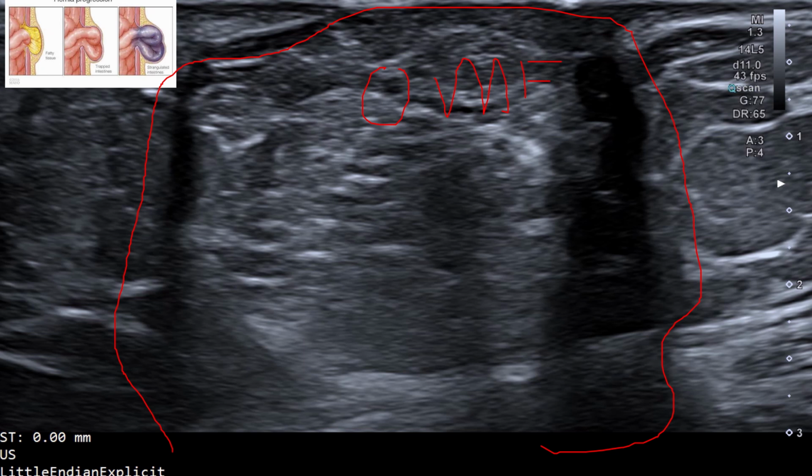So you can only have omentum or fat trapped inside the hernia, or it can be fat and bowel. When there is only fat trapped, it's just an omental hernia. So it can be both omental and bowel hernia. So there are different stages of a hernia. You can have only fat, or bowel and fat, that can herniate into the umbilicus, as you can see there.